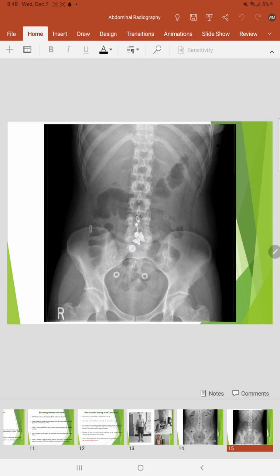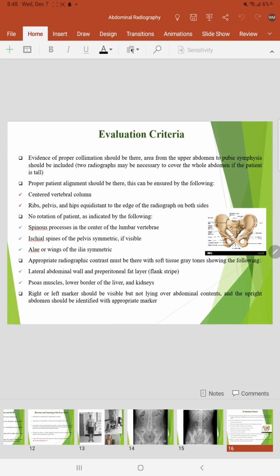There are some issues, some errors. It may be some hair bands or hairpins.